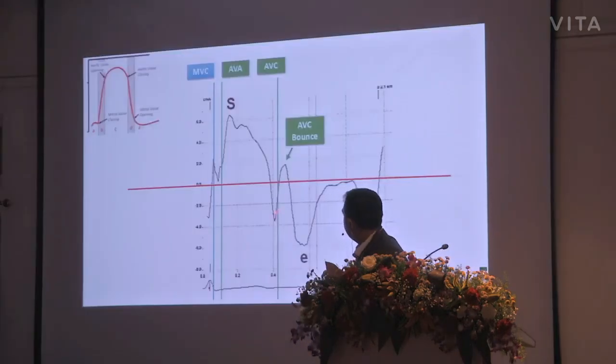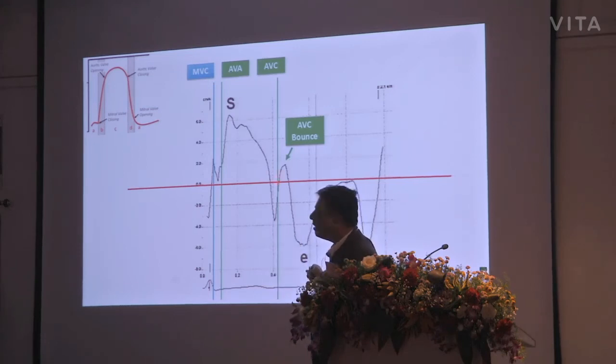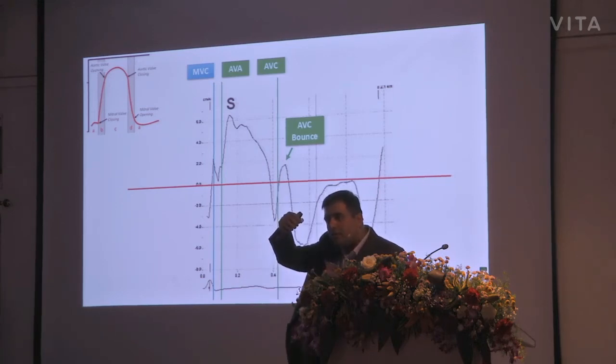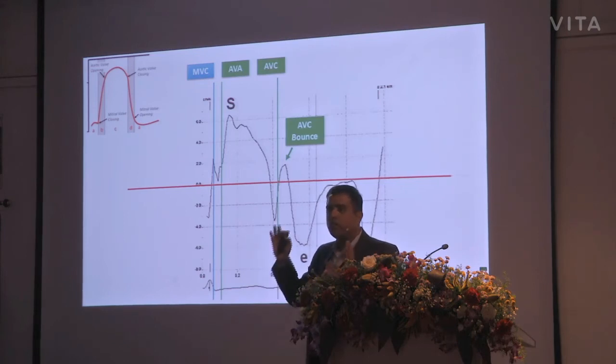So back to our figure over here, this negative spike is because of that systolic notch, is because of the fact that there is a negative pull of the epicardium that is taking place at that end of that aortic valve closure. So we have aortic valve opening, which is the start of that limb. The limb extends down, and you have a negative part. You have relaxation part taking place within the systole. And this was, hey, how can you have relaxation taking place during systole? The relaxation is because of that epicardium, which is actually elongating, actually relaxing at the end of systole. And the end of that negative spike is where the aortic valve closes. So we have reached milestone number 3. We have pointed out where the aortic valve closes.